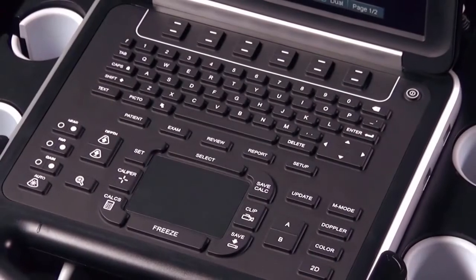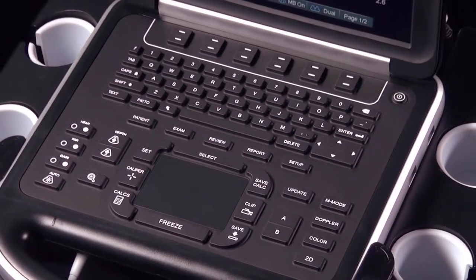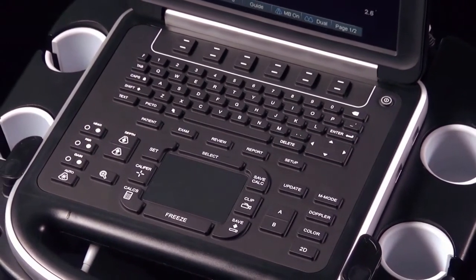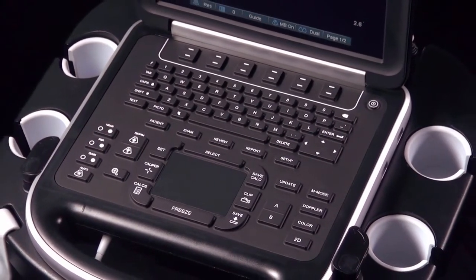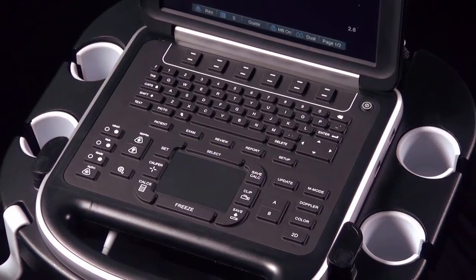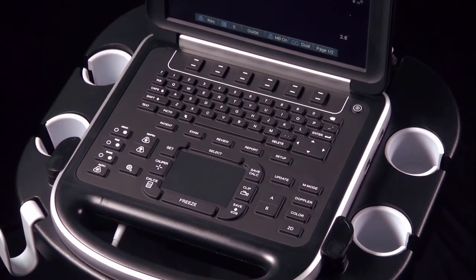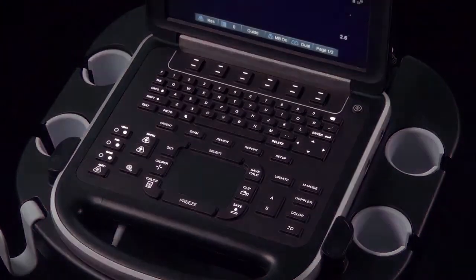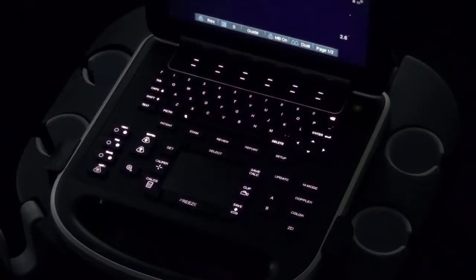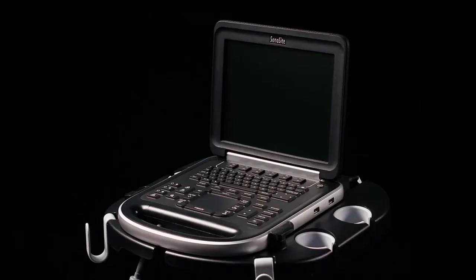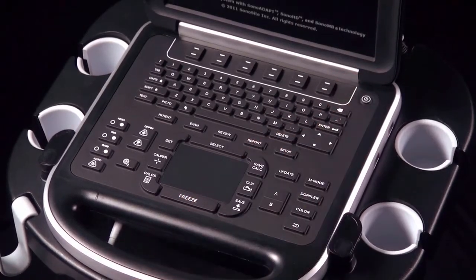The system control panel is simple to use. Many controls and features are automated to simplify the user interface and minimize the number of keys. The keys are backlit for easy viewing in darker environments. To turn the system on, press the power key once.